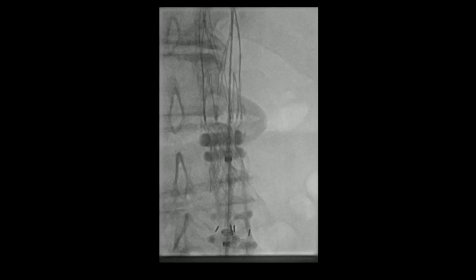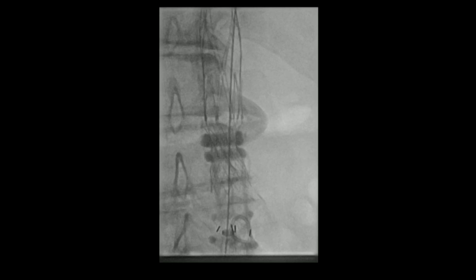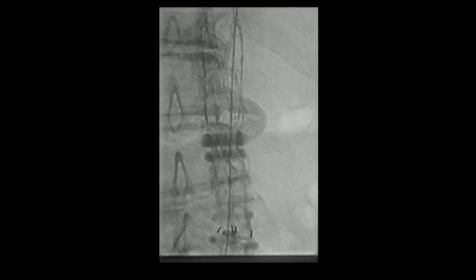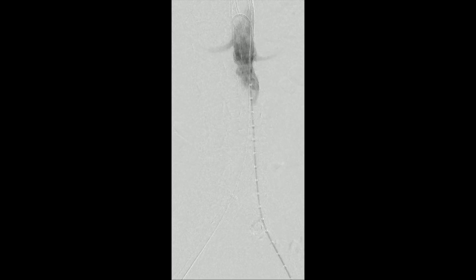The balloon is removed under fluoroscopic guidance, and a flush catheter is re-advanced. No further type 1a endoleak was appreciated on completion aortogram.